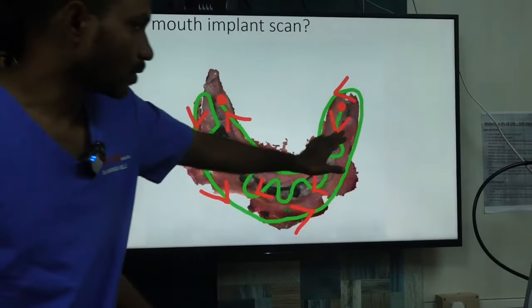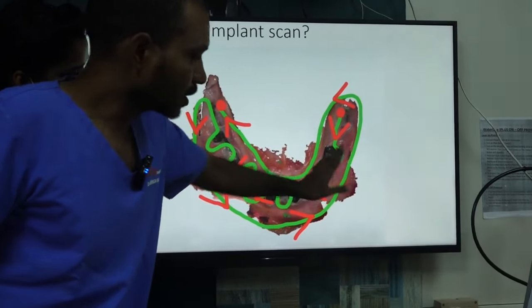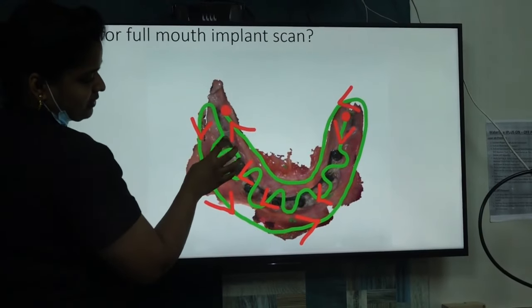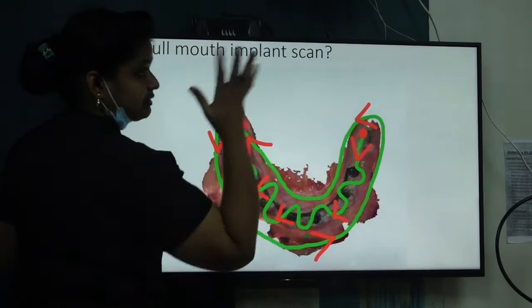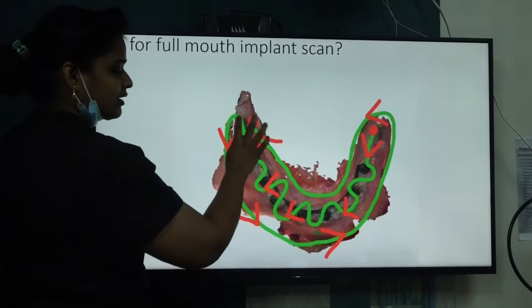So what you are doing is, you are not only covering the top of the implant, you are covering the buccal ridge and lingual ridge also. Then after reaching the opposite side occlusal surface of molars, you have to go till the pterygoid, both sides, slower. Pterygoid, sorry, retromolar. Then either you can go lingually or you can come buccally.